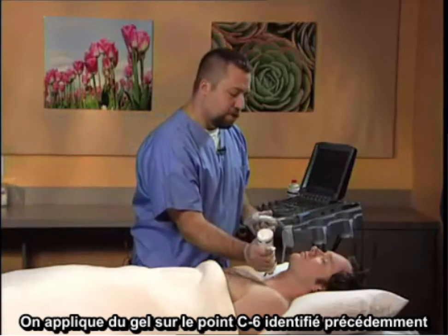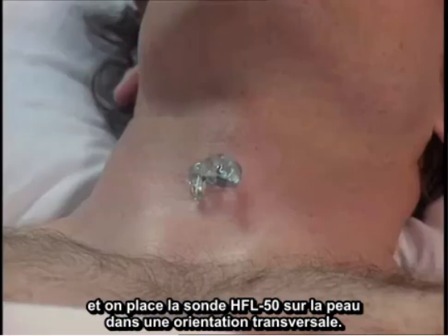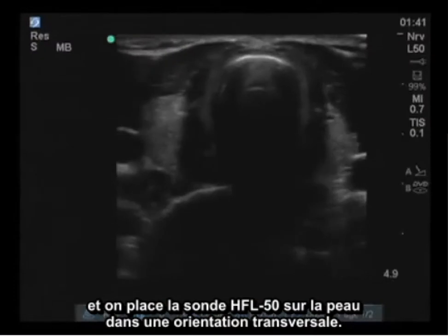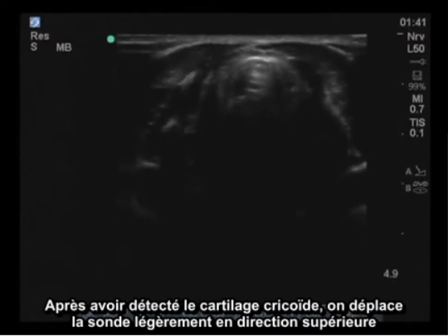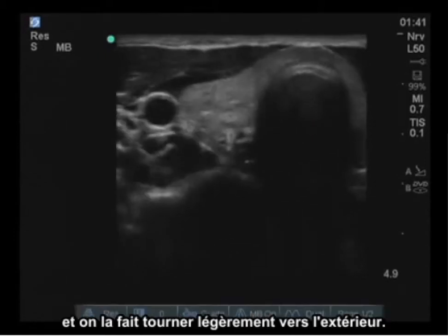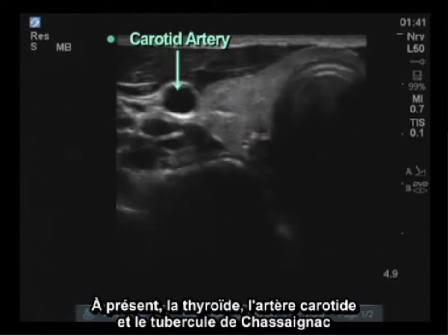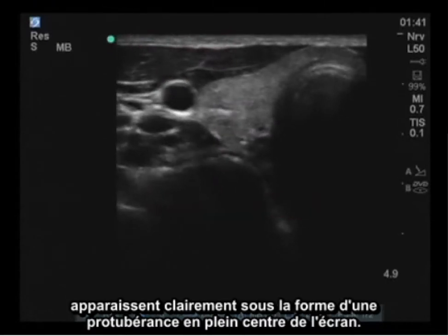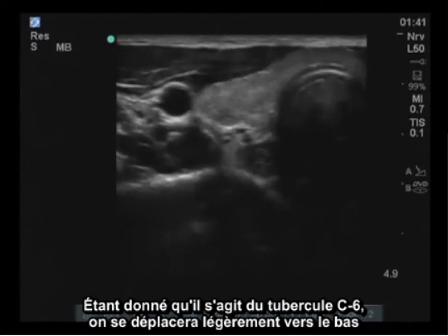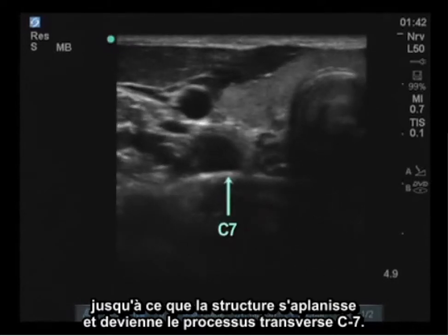Gel is placed at the formerly marked C6 level and the HFL50 probe is placed on the skin in a transverse arrangement. The initial view is of the cricoid cartilage, and then the probe is moved slightly cephalad and rotated slightly outward. At this point, the thyroid as well as the carotid artery and Chasniak's tubercle are clearly visible as the hump located immediately in the center of the screen. Since this is the C6 tubercle, we will move slightly inferior until it flattens out, and this becomes the C7 transverse process.